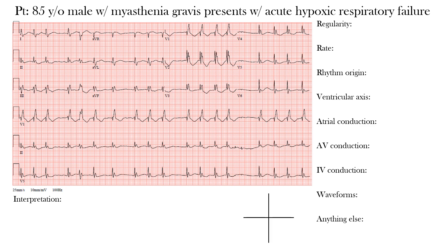One of the easiest ways to assess regularity is by finding the R waves. Looking at the V5 rhythm strip, here's one R wave — the distance to the next is called an R-to-R interval. We look at whether those intervals are consistent throughout and of equal duration. Looking across this EKG, you can clearly see these are not the same duration from one R wave to the next. The R-to-R intervals vary throughout.